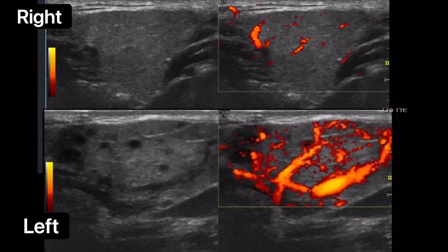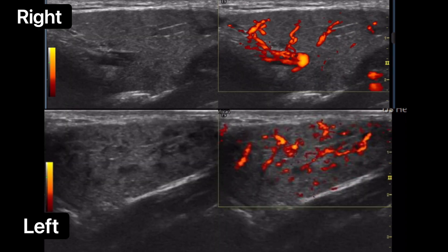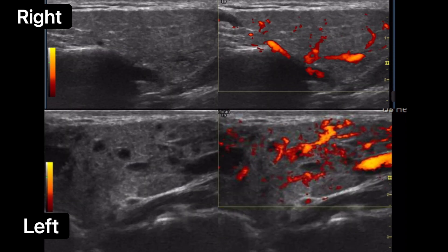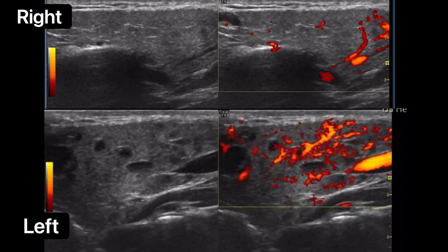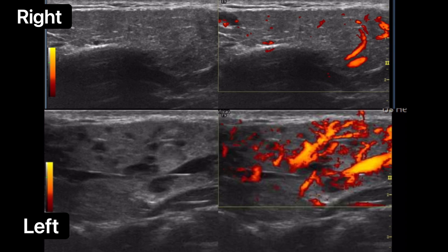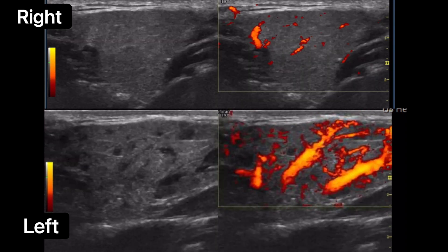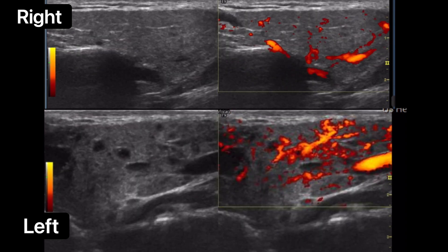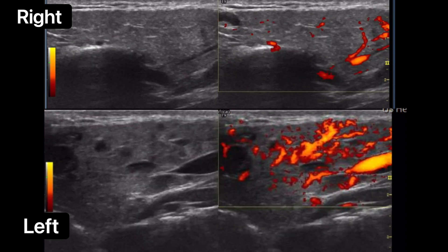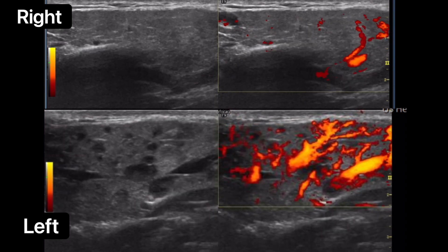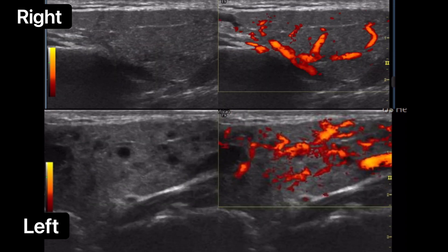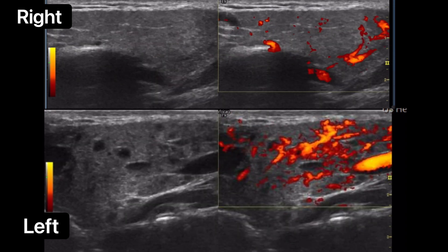Here are two examples of the parotid gland, right and left. The upper part is the right gland and the lower part is the left gland. You can see that the left gland is hypervascular or hyperemic when compared to the right, and also has multiple hypoechoic areas.